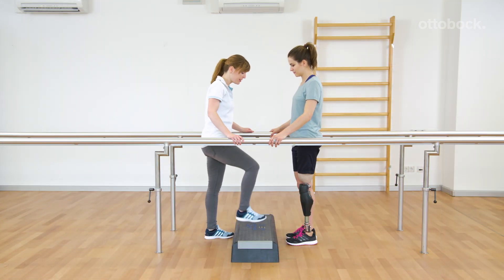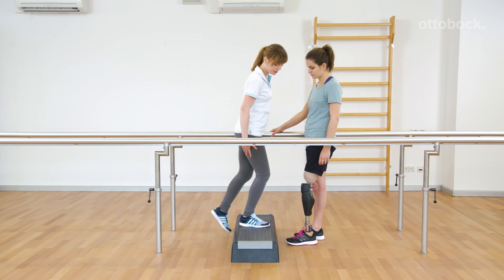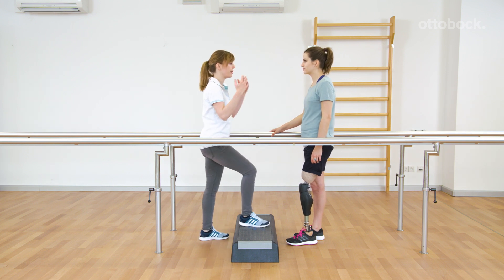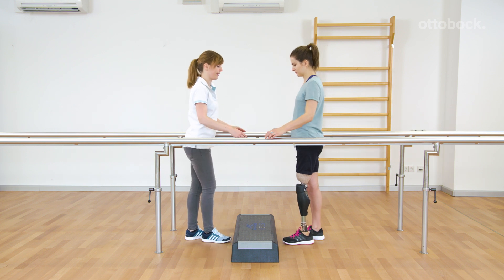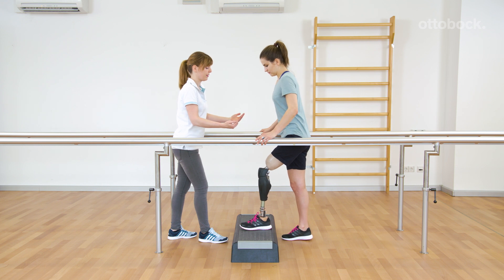If the foot is correctly placed fully on the step, the center of mass should move forward and up. Therefore, it is easier for Rika to actively extend the residual limb when stepping up. As long as the prosthesis is loaded, the knee remains blocked in the flexion direction.